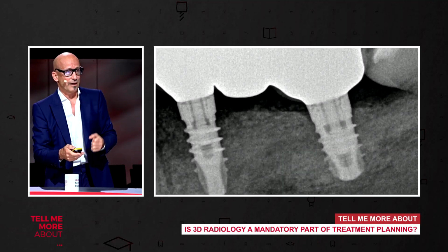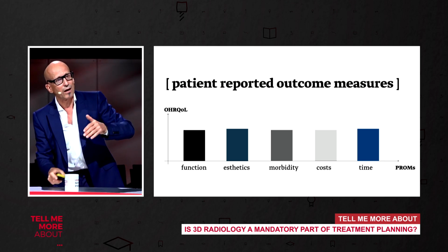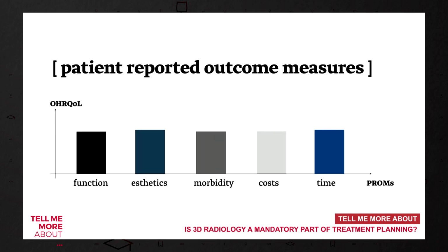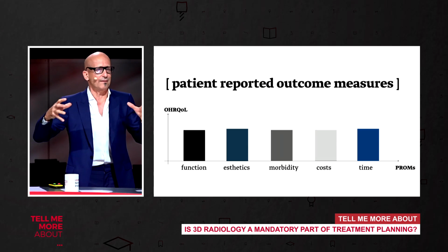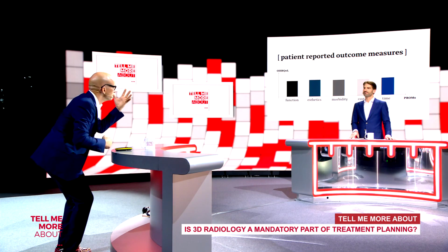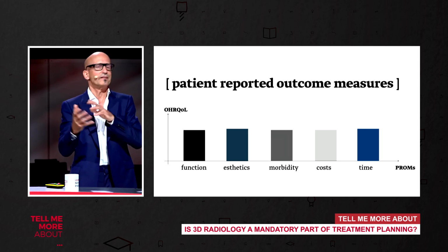This is the radiographical outcome of this patient. And now we are in another situation. Now all of a sudden, we are more cost effective, much more cost effective. We see the patient 3 times. The time shrinks from 20 to 22 months to 5 months. I mean, this is another world. And this is because we have this new technology. Because this technology allows us to do things now in a different way.